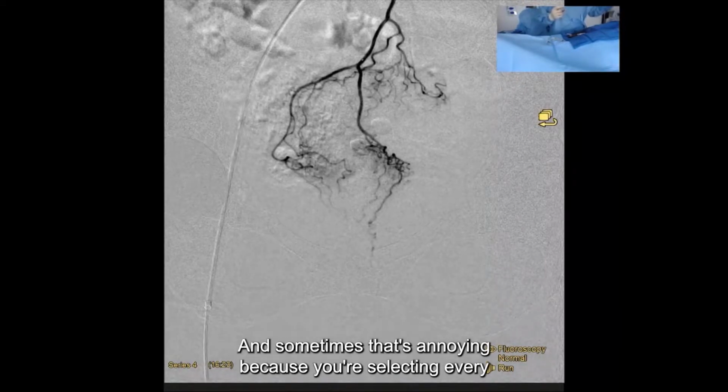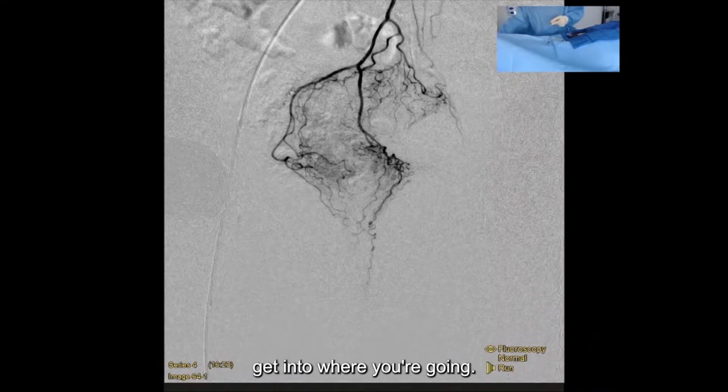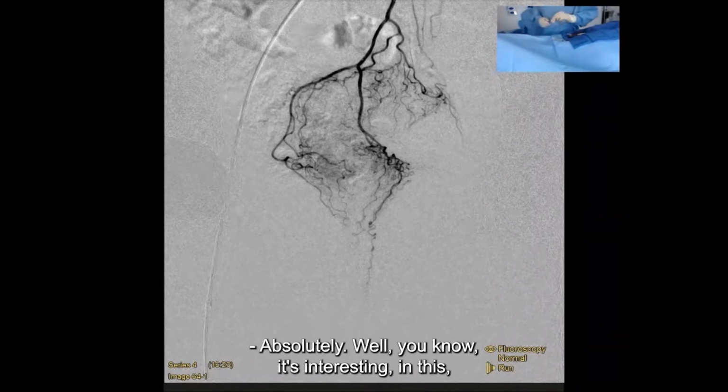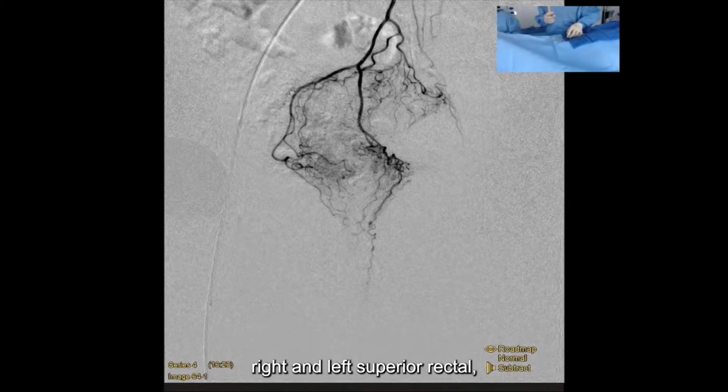Now sometimes that's annoying because you're selecting every little branch as you're going, but other times that's what you need to get into where you're going. Absolutely. Well, you know, it's interesting. In this particular case here, as you can see, we've now done our angio here at that bifurcation of right and left superior rectal.